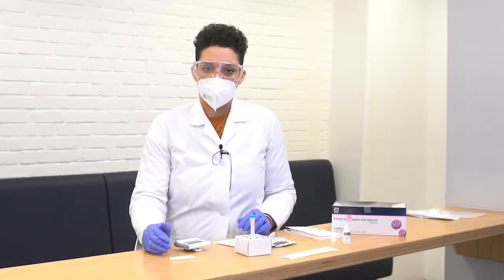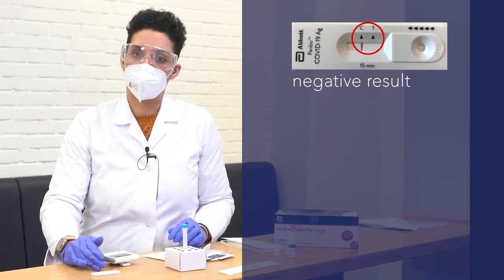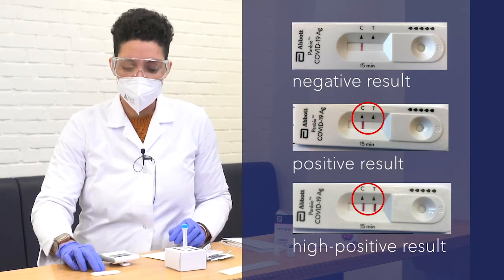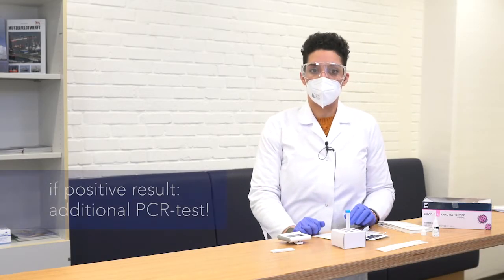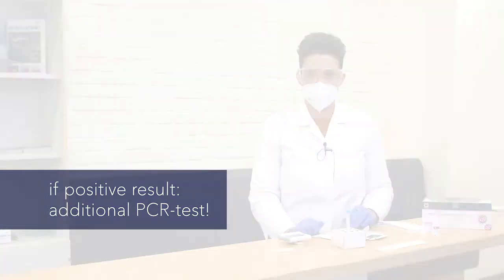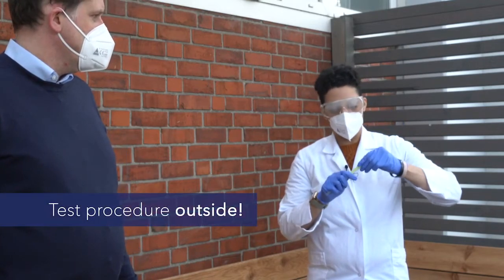There's 2 lines going to show up. The C marker always has to have a line. That means control. So it shows you if you did the test right or if you did the test wrong. If you have both lines showing up at the C and T marker, that means your test is positive. If you are tested positive, then it's going to be necessary for you to do an additional PCR test.